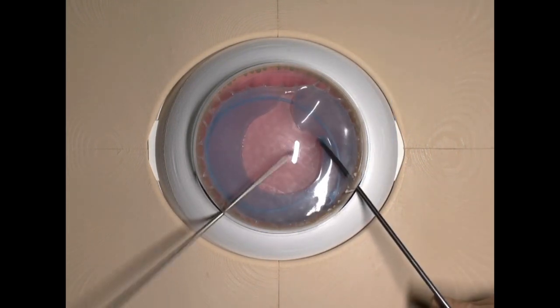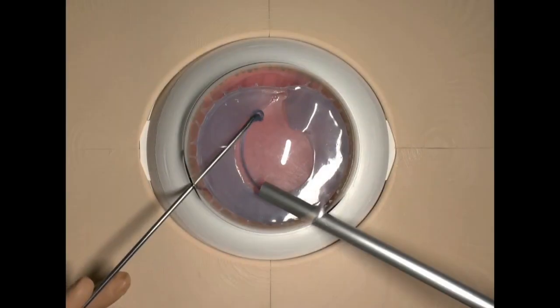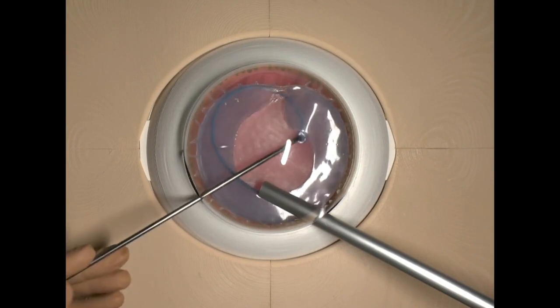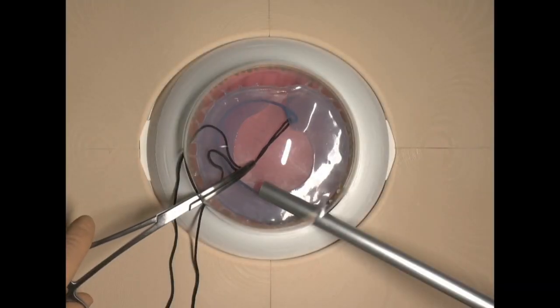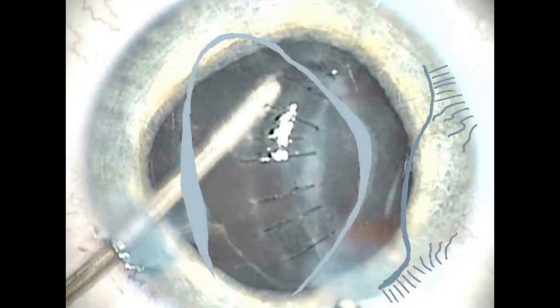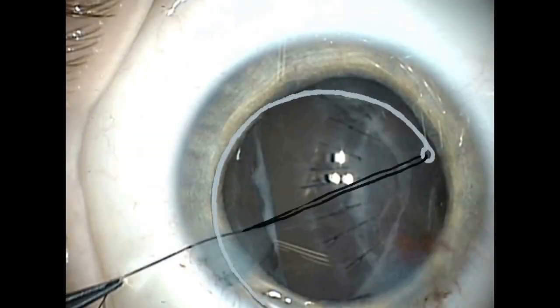Fish tail technique can lead to deformation in some rings. Capsular tension ring can be led by a hook. When leading the ring with a suture, the ring can be mobilized repeatedly and by keeping the suture, the risk of dropping the ring is lowered in complicated surgery.